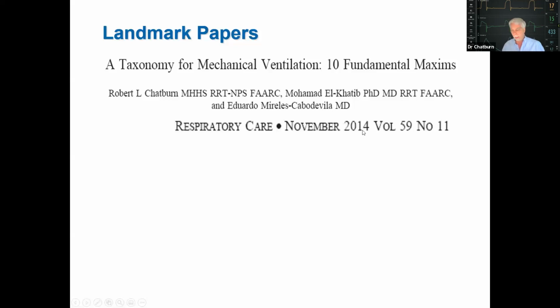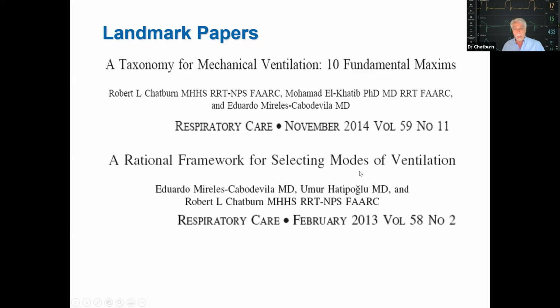And this is now, what, some 7 years ago. And a related paper was, once you can identify modes and classify them, you need to understand what their technical specifications are and what their capabilities are that make one mode perhaps more robust than another mode for a given patient need. So these two papers go together. Once you identify modes, you're able to rationally select amongst all these modes.